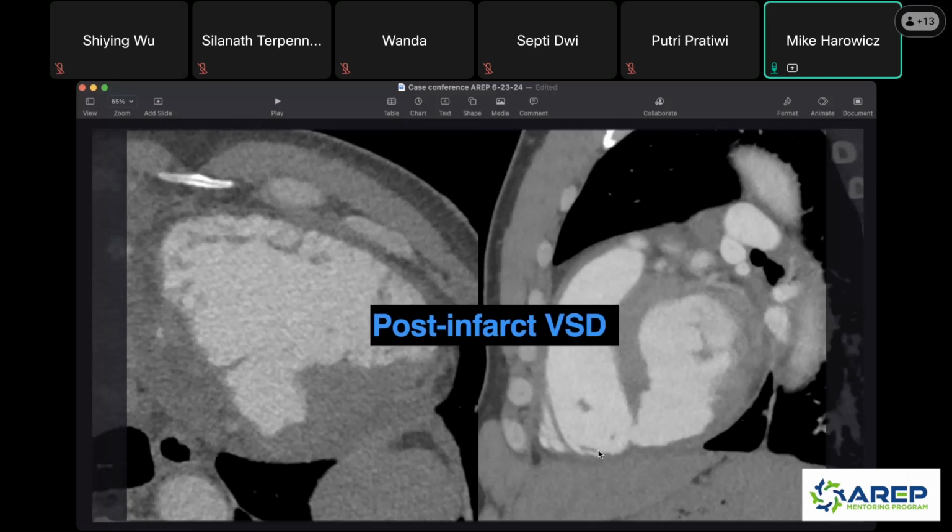Because they're not just seeing blood from the right ventricle, they're getting all that extra coming from the left ventricle too. So you're overloading your pulmonary arteries with all this blood. Presumably, the pressures are going to go higher because if you have more blood, more pressure. And that is going to cause fluid to leak out from those pulmonary arteries into your pulmonary interstitium and into your pulmonary alveoli, which is what gives you the pulmonary edema, right? And this happened presumably pretty abruptly. It just burst, and that's why this person had acute onset shortness of breath.